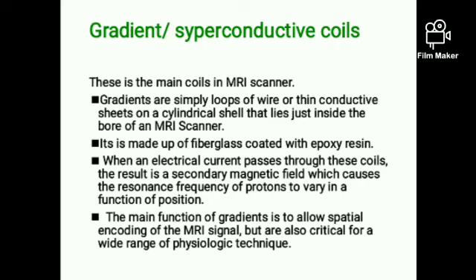Like, if I am a student of this college, I have to show the identity card, and only then will I get permission to enter the college. So that is what resonance means. If your external frequency matches with the internal frequency, then only the protons will create the image, and that image will be captured via the gradient coil, and it will produce the image.